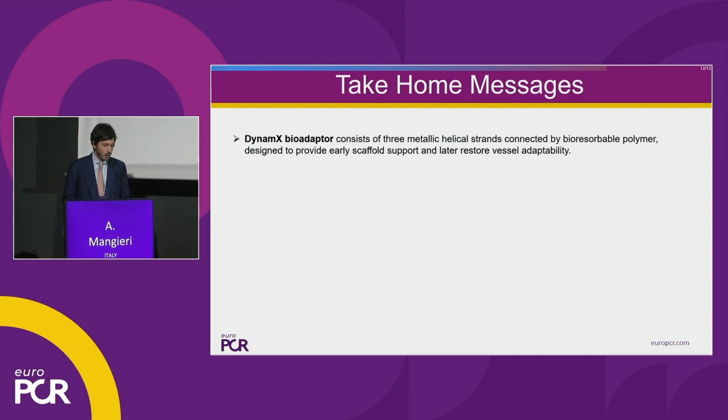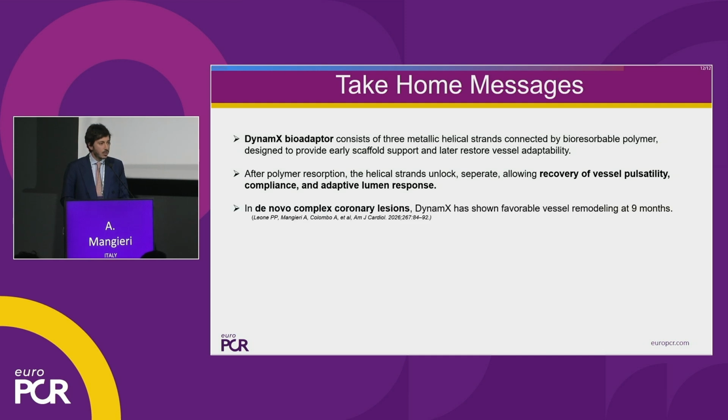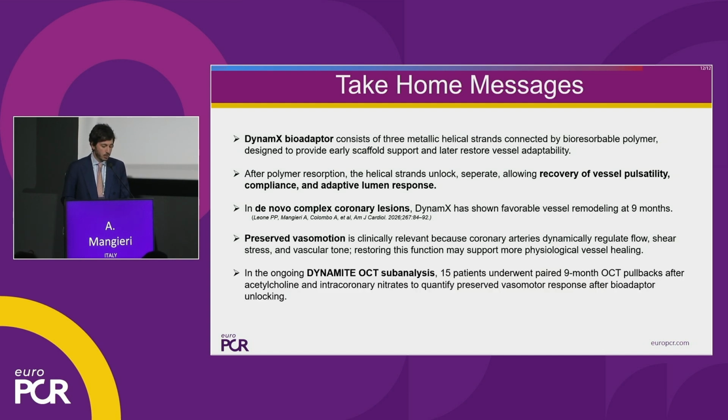So I will not go longer, but I will say that essentially this new technology will allow us to treat more complex lesions, as demonstrated by our studies, and of course we will be able also to see a vasomotor reaction in these patients that can potentially benefit from this vasoreactive motion that is not observed with the normal caging with the standard DES platforms.